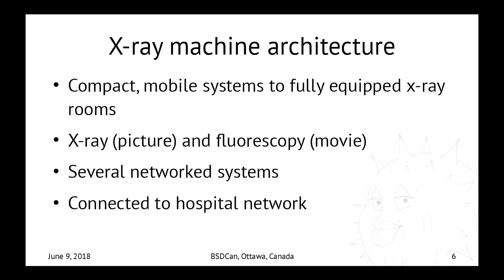The X-ray machines we're dealing with here are everything from pretty compact mobile units, like a little drawer, a meter by a meter and a meter 50 high or so, to fully equipped X-ray rooms, maybe half the size of this room, typically. The digital ones, the halfway recent ones, are technically not X-ray machines. They're digital fluoroscopy machines, and, well, what is fluoroscopy? Basically, X-ray is a picture, fluoroscopy is a movie. So you can watch a joint in motion and stuff like that.